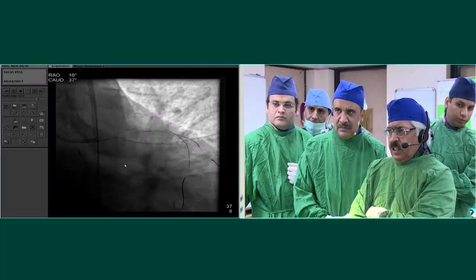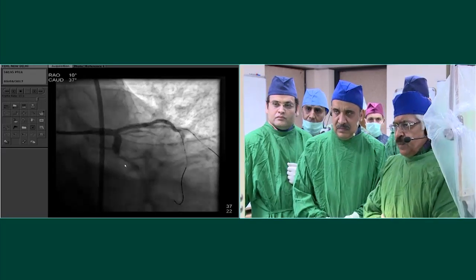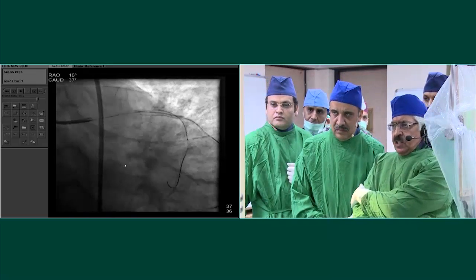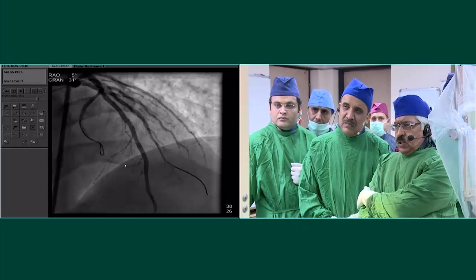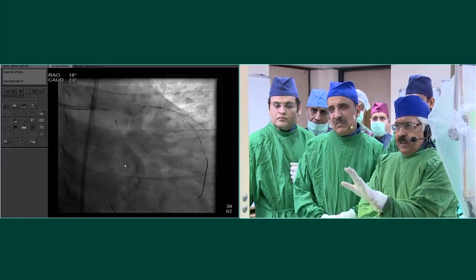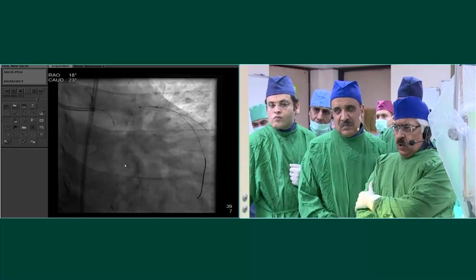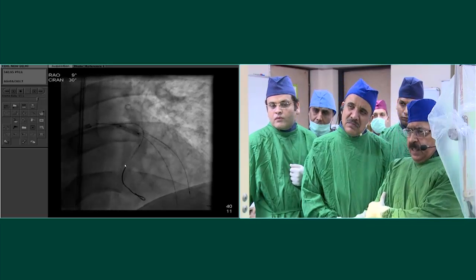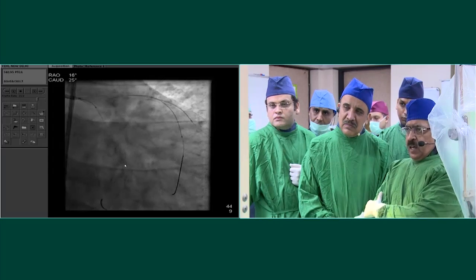And I have stented it, and you can see the marker on the scaffold which covers slightly the ostia of the circumflex, but certainly catches the ostia very well. So this is implanted at 6 atmospheres, and now I've got to do post-dilatation at high pressures. Next. So I took in a 3.75 balloon, and I positioned a balloon and a wire in the circumflex to be sure that I do not compromise the circumflex. And here I'm going up to 20 and 22 atmospheres with a 3.75 balloon. Next. I've done that across that diagonal. Next. And I've done that here. Next. And I've actually done it on the ostium as well at 22 atmospheres.